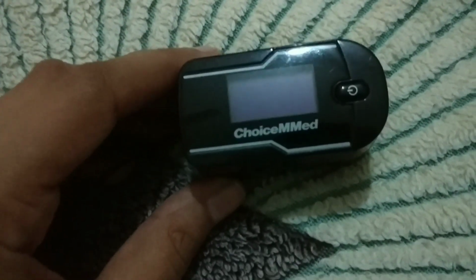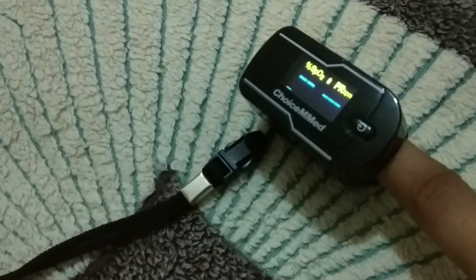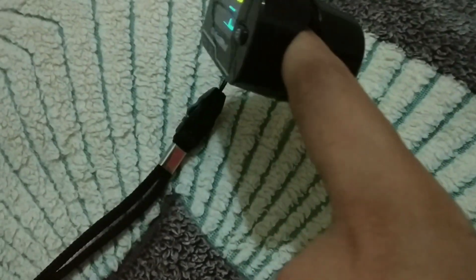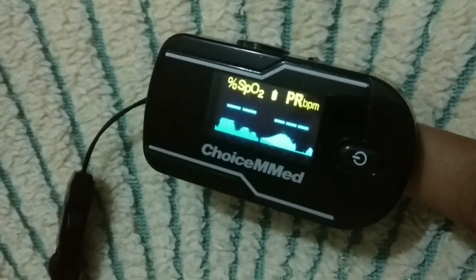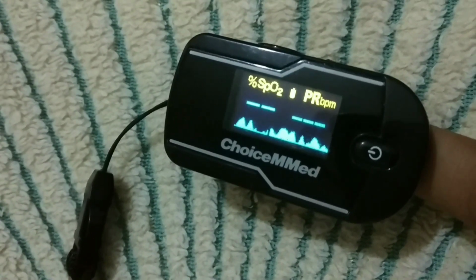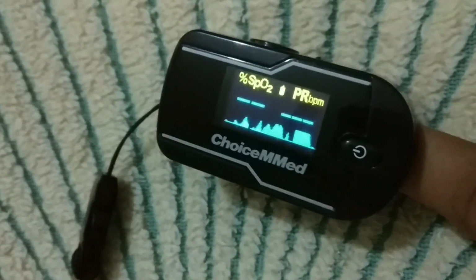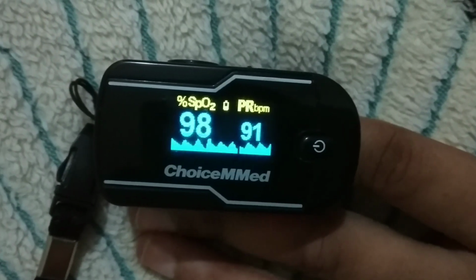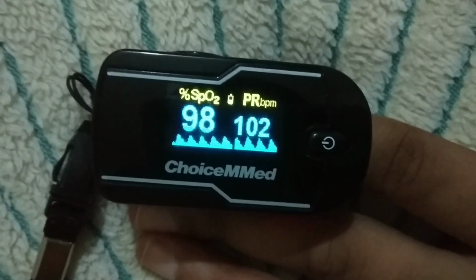And the next one is more compact and it checks for our oxygen level and our heartbeat level. So you have to insert your index finger over here, and SpO2 is nothing but your oxygen level, and PR BPM is your heart rate level. And my oxygen level is 98 and my heart rate is 102.